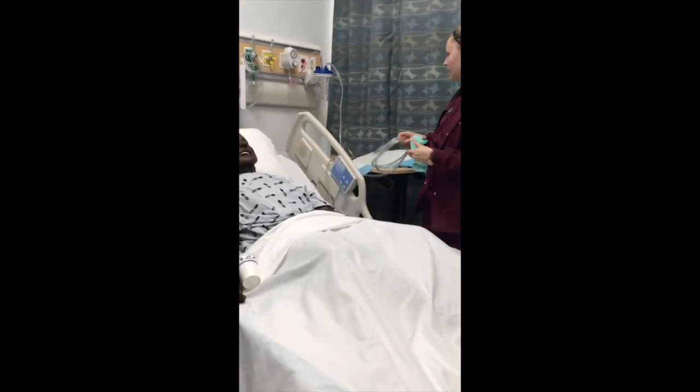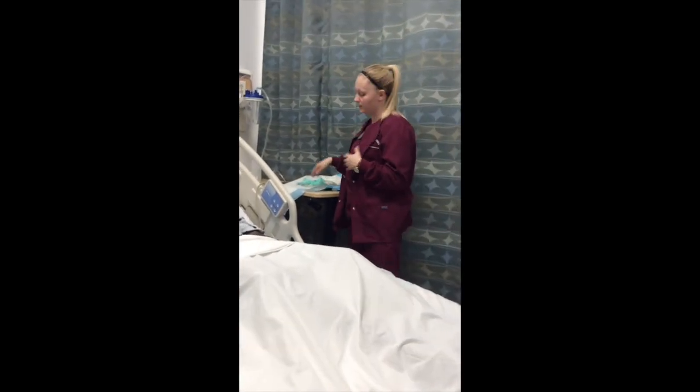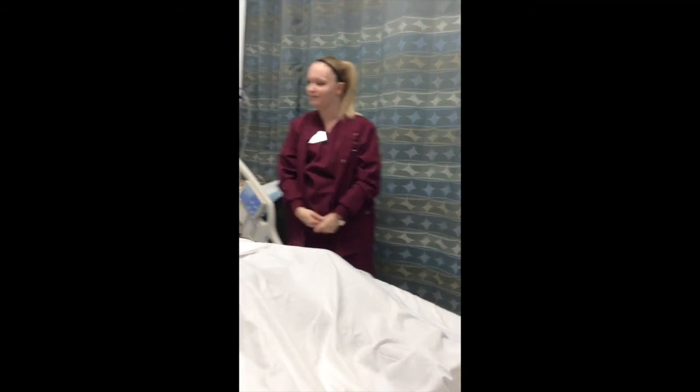I'm going to clean up everything, probably get this out of the room and everything, and document my final output, and put the call light in reach and let them know to let me know if they have any questions.